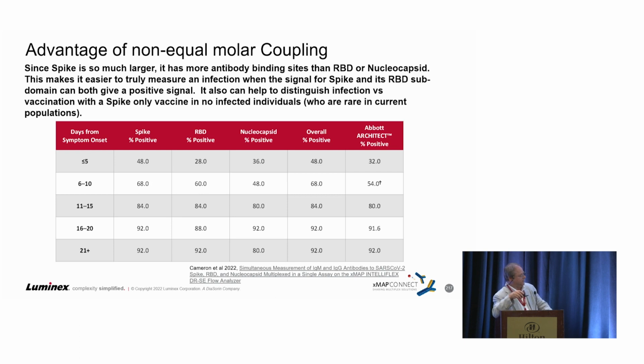So this is from the first paper where we were looking at it in the FM3D, and we later, as Sherry was mentioning, brought this over to the iFlex, but we also did neutralization in both instruments.